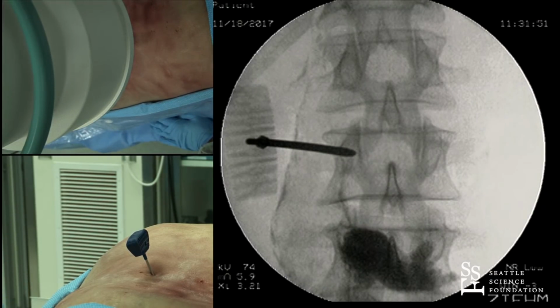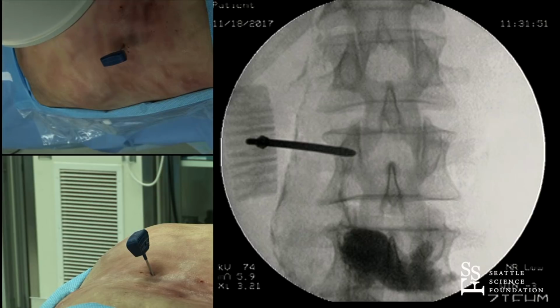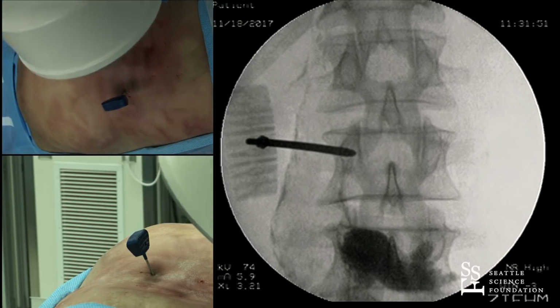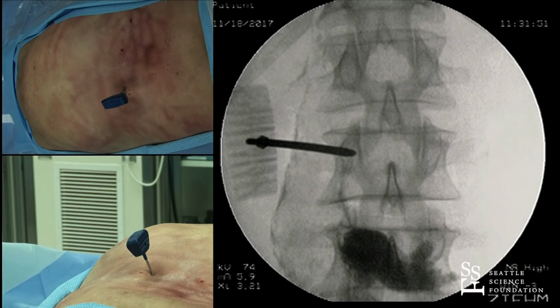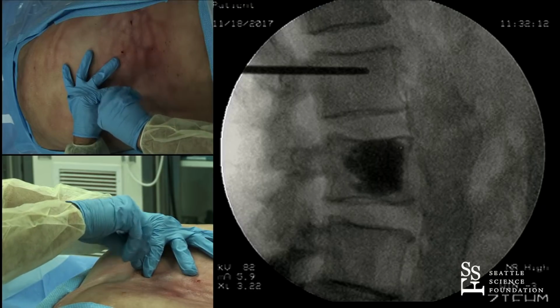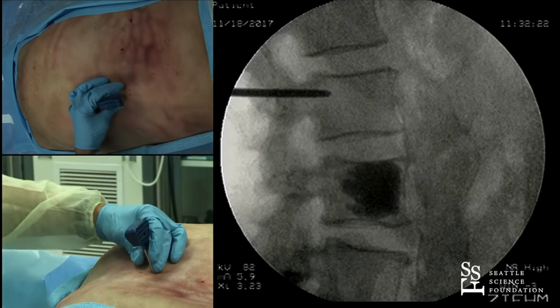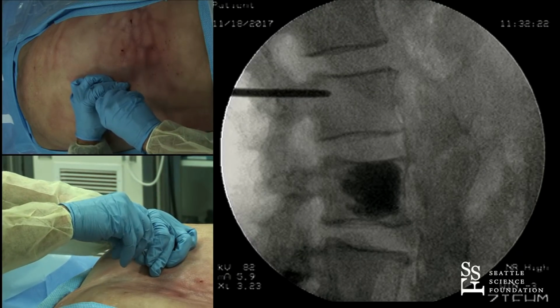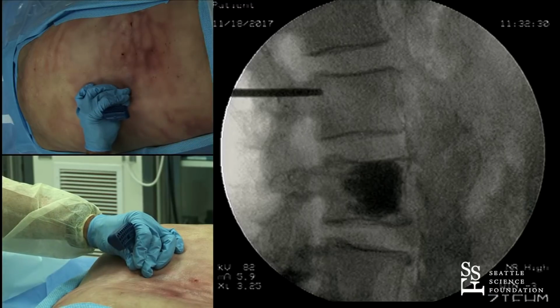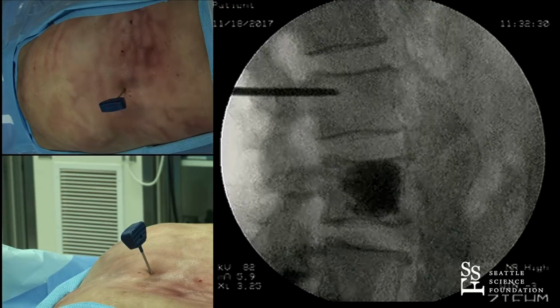And so this is a good flat approach. We want to go lateral. I change the trajectory with the single bevel needle to make it a little bit more steep approach. And what we'll see here is we'll very likely be past the posterior border of the vertebral body. So we are. So we're going to back this up right about there. I'm going to back it up just a hair more. And I'm going to change the trajectory a little bit. I'm going to go just a tad more medial. You can see from the trajectory change I'm putting on the needle. And we'll stop right there.